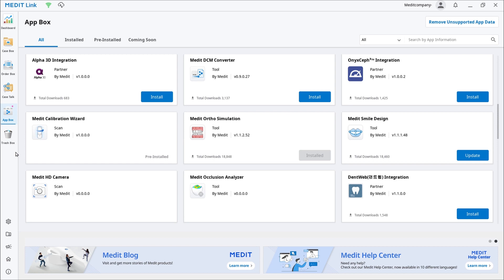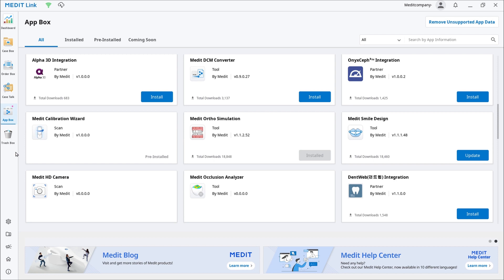You can use preset teeth templates and customize them with various tools to modify their color, shape, position, and scale. You can also simulate and preview metal and ceramic braces.